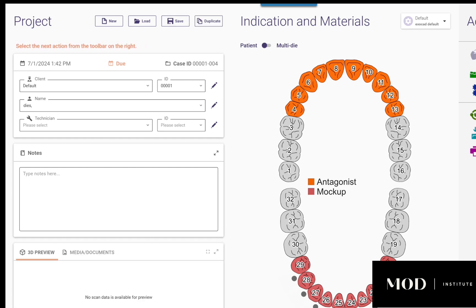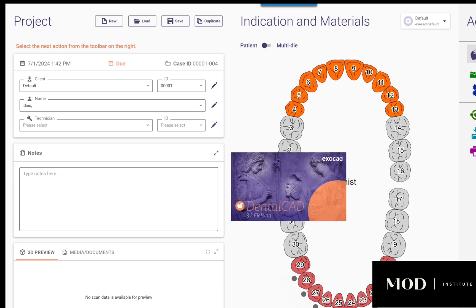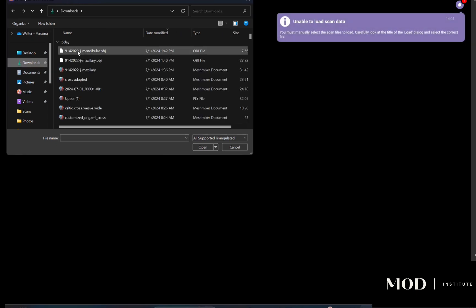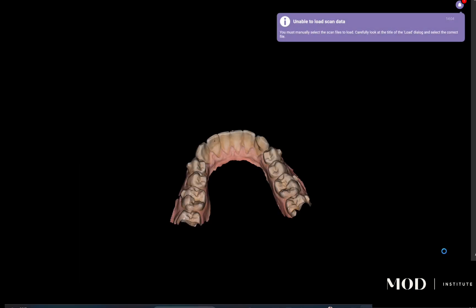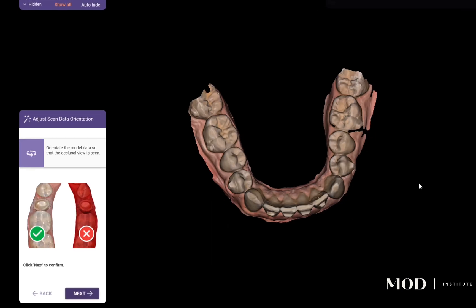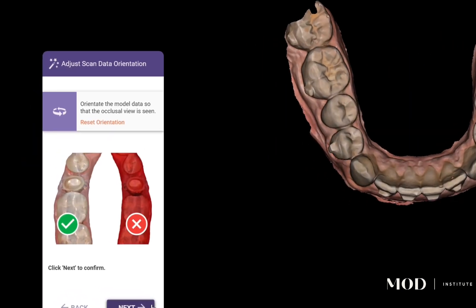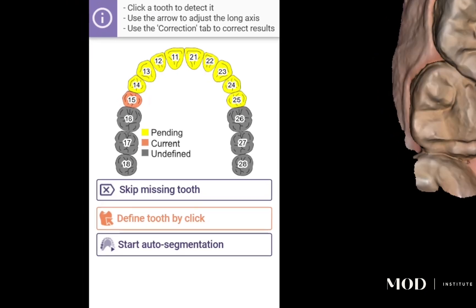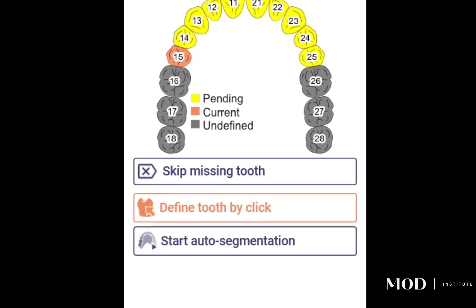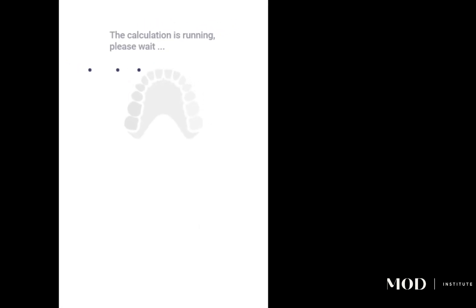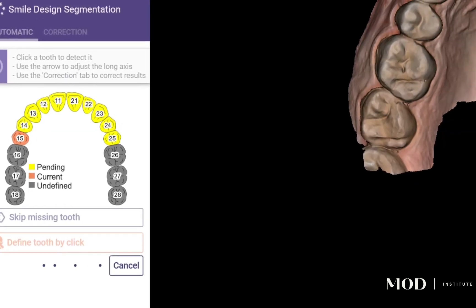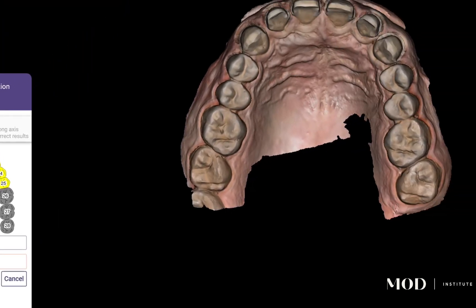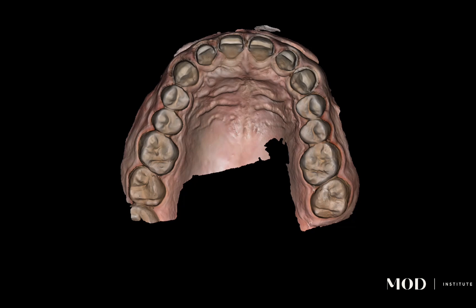Now I'm going to leverage the power of the new ExoCAD 3.2 AI tooth segmentation feature. I'll quickly load the lower and upper jaws. In the upper jaw I have a combination of prepped and no-prep veneers. I'll hit 'start auto segmentation' — this is a new feature in ExoCAD 3.2 that leverages artificial intelligence for tooth segmentation and identification.